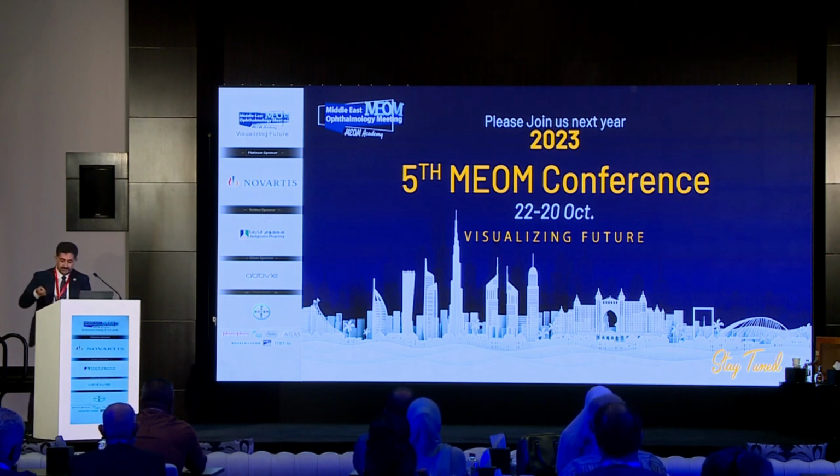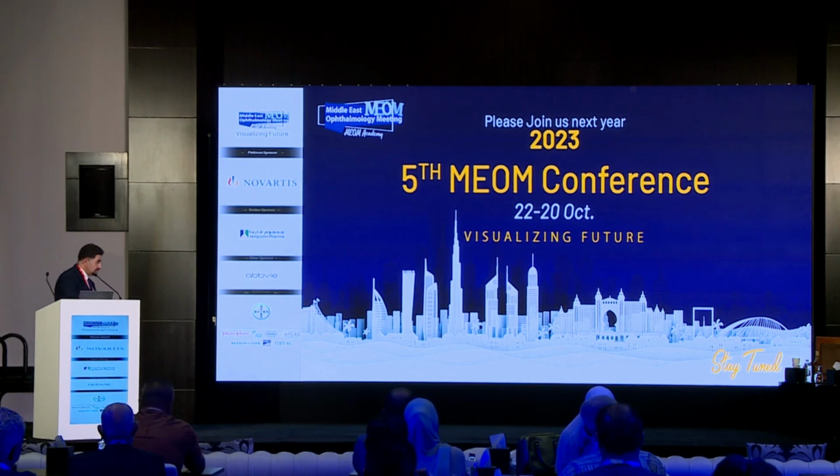شكرا دكتور أشرف. هل في preference ما بين ال type of intraocular lens اللي you implant in a case of subluxation, whether you have capsule tension ring or not, a 3-piece versus 1-piece, overall diameter?